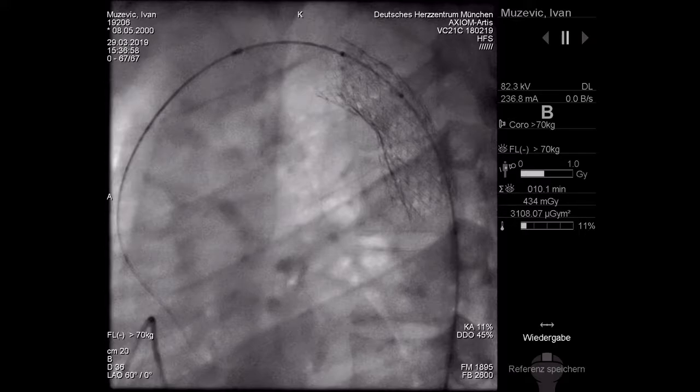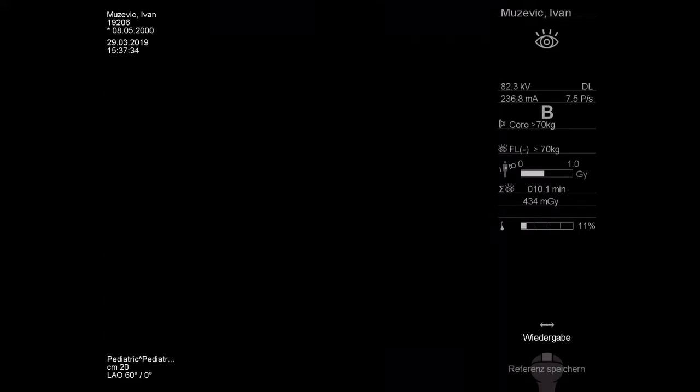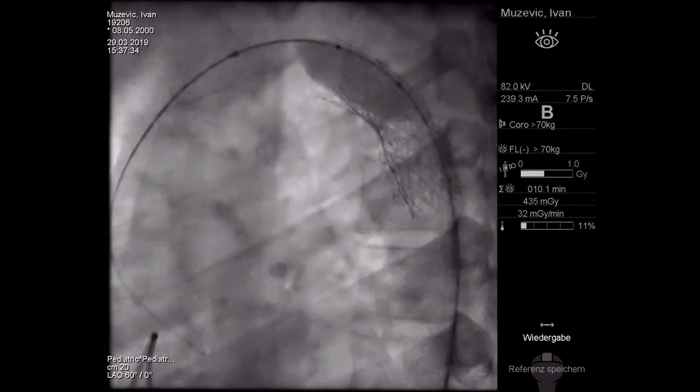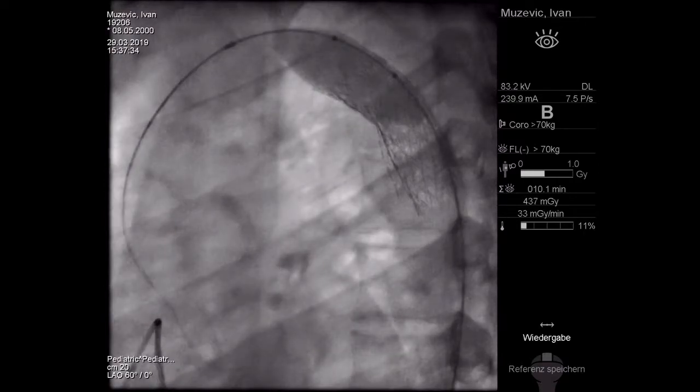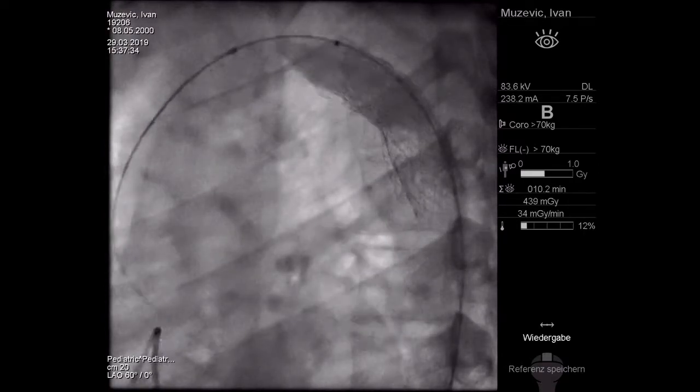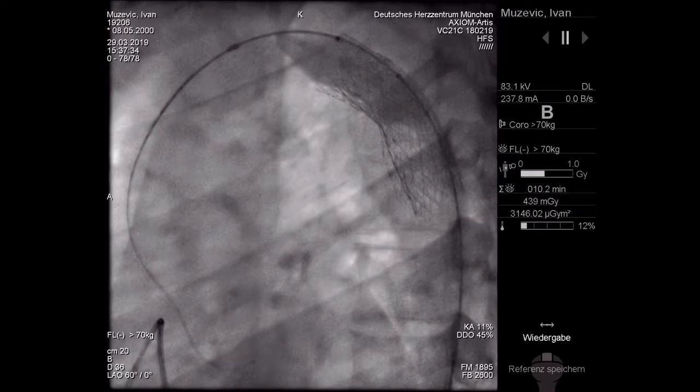Okay, so we take 3 atmospheres at the beginning. Yeah, go ahead. Yeah, 3. Okay, that's enough. Stop. Take it out. Save it. Okay.